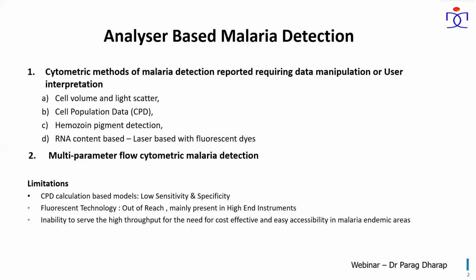CPD-based calculation models have shown low sensitivity and specificity. Fluorescent technologies are yet still out of reach as they are mainly present in high-end instruments. There is also inability to serve the high throughput, the need for cost-effectiveness or affordability, and easy accessibility in malaria endemic areas.